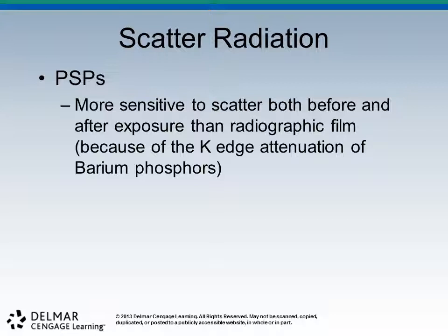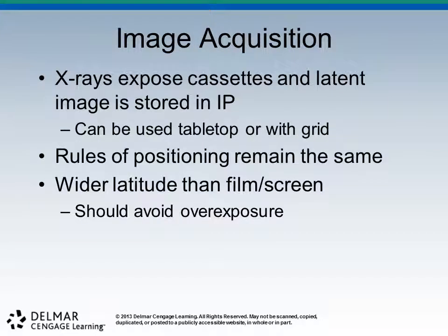That's all this is saying. They're more sensitive to scatter than radiographic film. So if the question is from film to CR cassettes, which one's more sensitive to scatter? PSP. Film is also sensitive to scatter, but this is more sensitive.